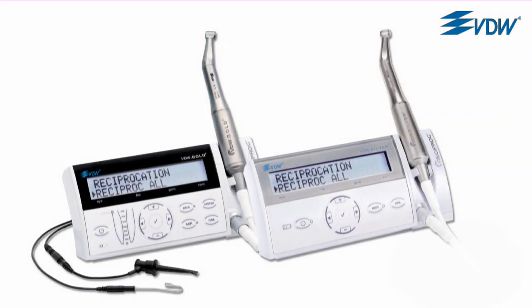VDW Reciproc motors have a newly developed Reciproc reverse comfort function, which is exclusive to VDW. When using Reciproc, it indicates when to switch from a pecking motion to a brushing file motion. This change reduces stress on the instrument and creates more space in the root canal for an easier advancement towards the apex.